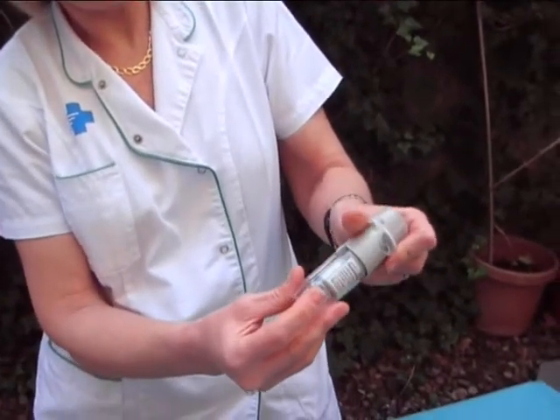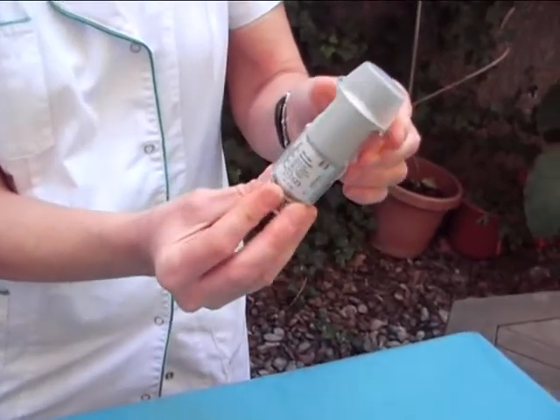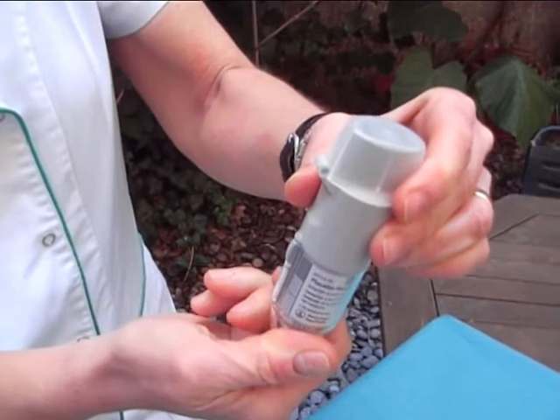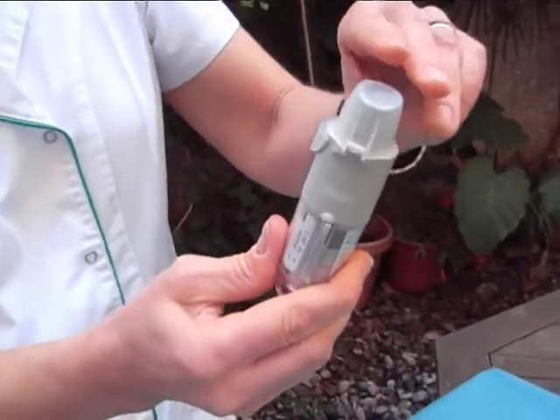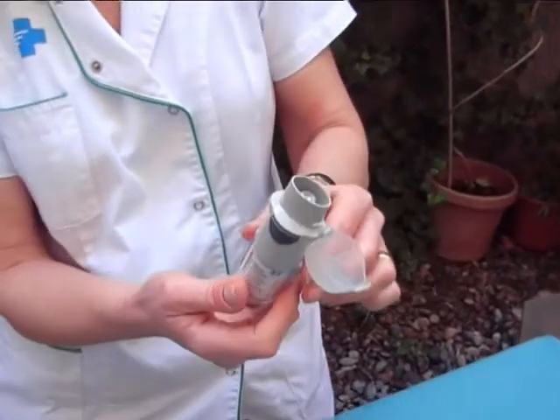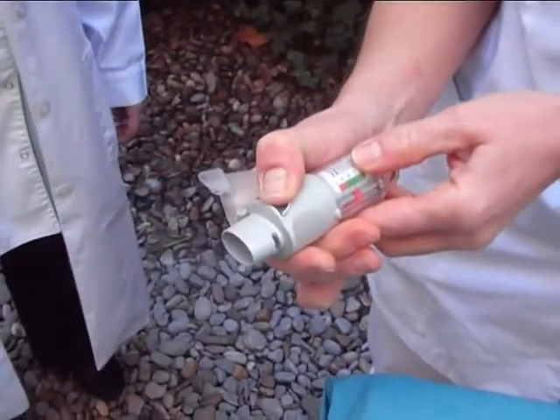Hold the inhaler upright and turn it in the direction of the red arrow until you hear a click. Open the cap, aim the inhaler to the ground, and press the Release Dose button. The white cloud is the medicine.